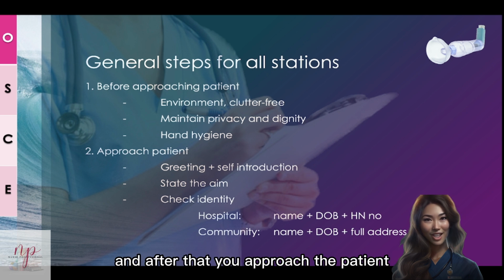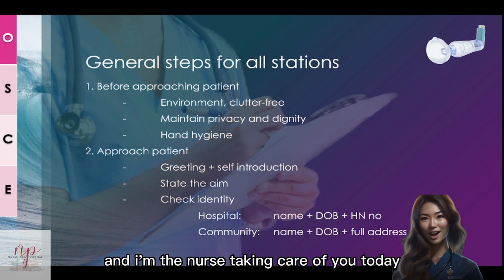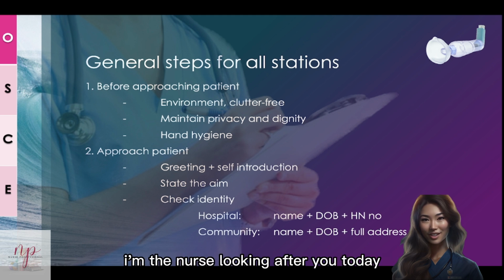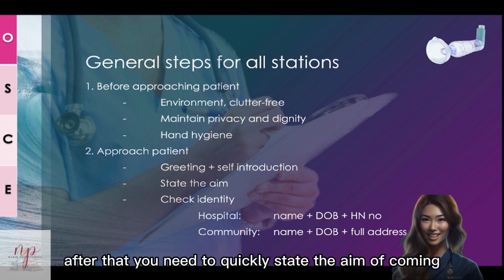After that, you approach the patient. You need to say hi to the patient and say who you are: I'm the nurse taking care of you today, or I'm the nurse looking after you today, something like this. Then you need to ask the patient, how would you like to be called, or how shall I address you? After that, you need to quickly state the aim of coming.